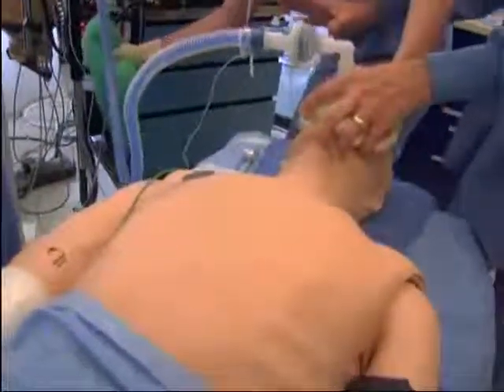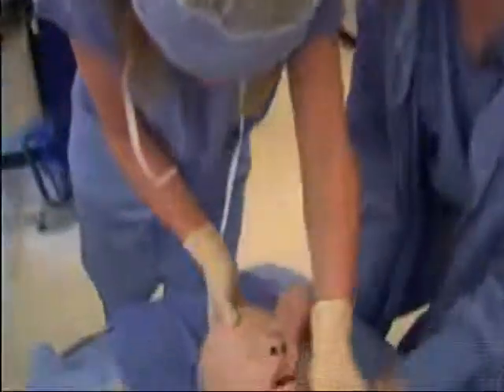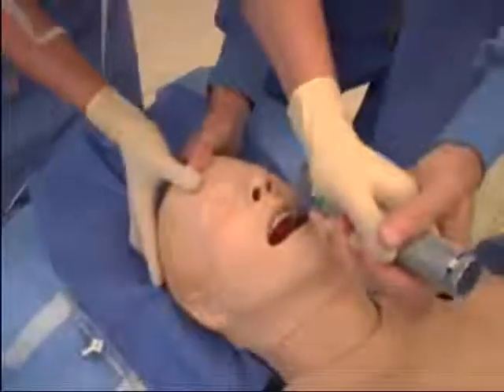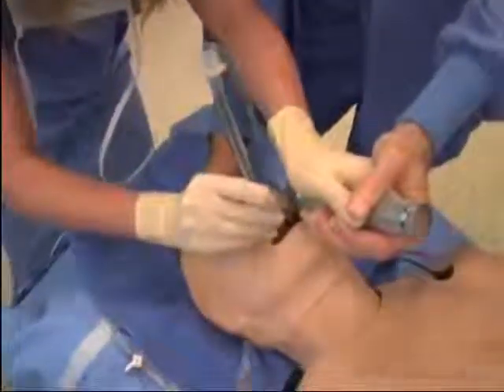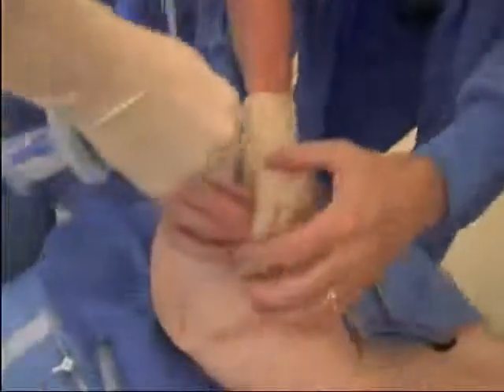Okay. So now we've got him. Let off. And then squeeze again. Not quite so far. Okay. Lift up, and then can you see the tube way back there? I do. Okay, put that breathing tube in. Can you still see where you've got to go? Yeah. Okay, put that in there. Shove it in a ways. Is it in a ways? Perfect. Okay, this goes on here? Right on there. Good. And you hold it there.